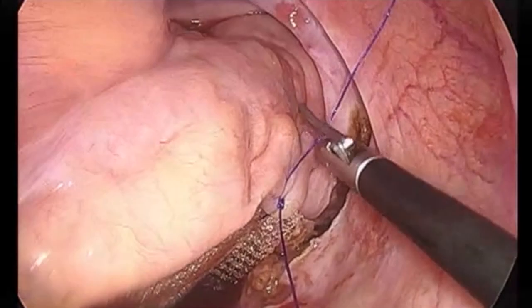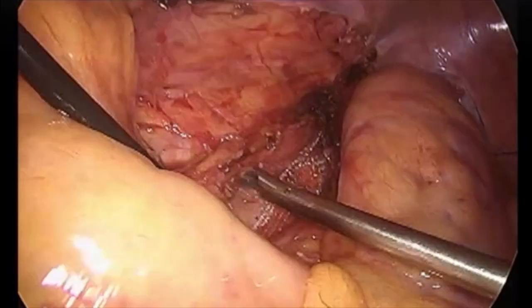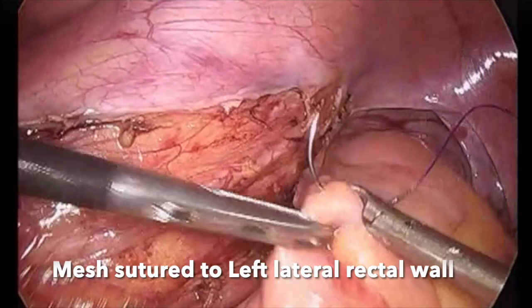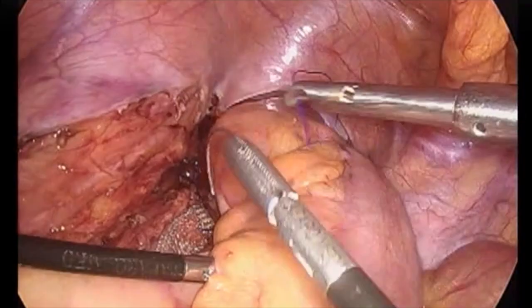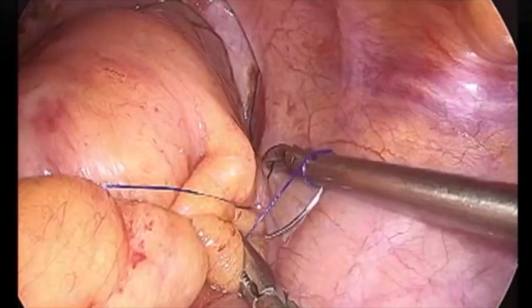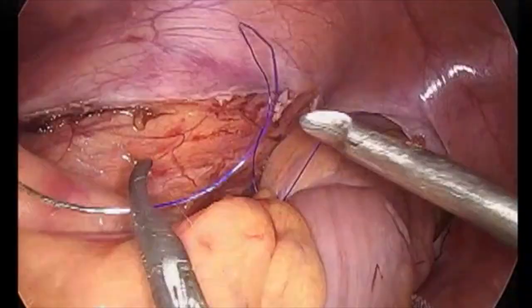Our principle is to first do a posterior dissection, then right lateral dissection, and once both are done, perform the left lateral dissection. The dissection is carried out just above the sacral promontory up to the level of the coccyx and pelvic diaphragm. Here you can see the mesh being sutured to the left lateral wall of the rectum, taking a part of the presacral fascia as well. It is very important to maintain the presacral fascia intact in order to reduce injury to the hypogastric nerves as well as to the presacral plexus.